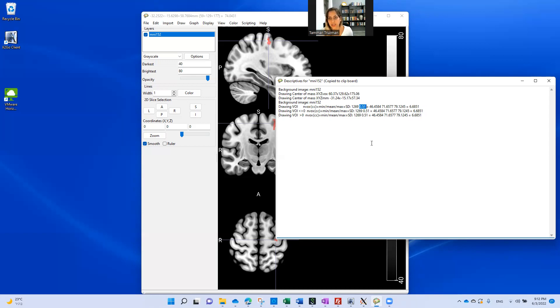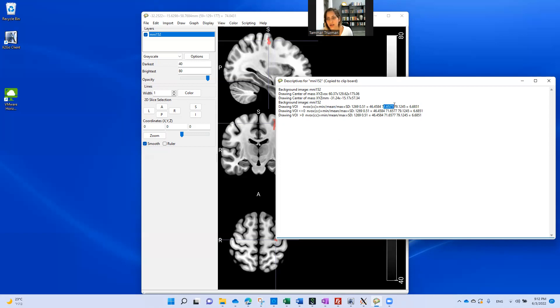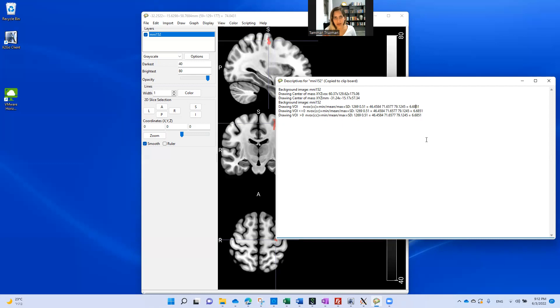They are within the brain. I have 1269 voxels and equals in volume cubic centimeters equals to 0.51. These values represent the brightness of each voxel within my VOI. The minimum, meaning the most darkest voxel, is 46.4 and the mean brightness of my voxel is 71 and the maximum is 79. And the standard deviation is 6.6. I can see that the average of the brightness of my voxels in the VOI are pretty much bright. So probably they are within the white matter also, and not only on gray matter.